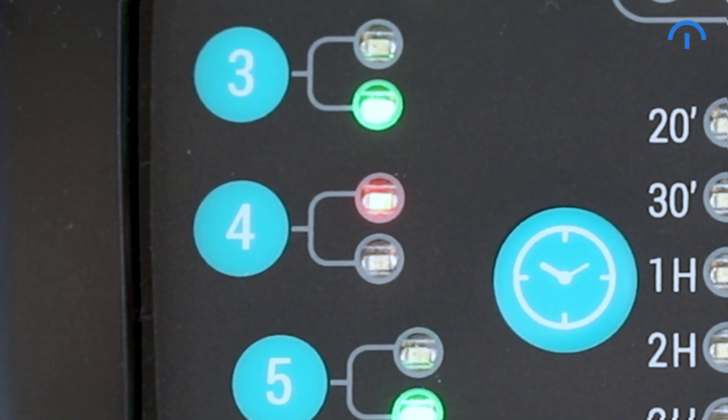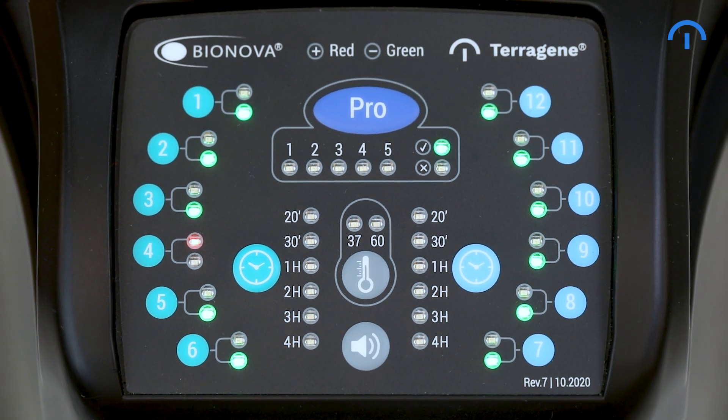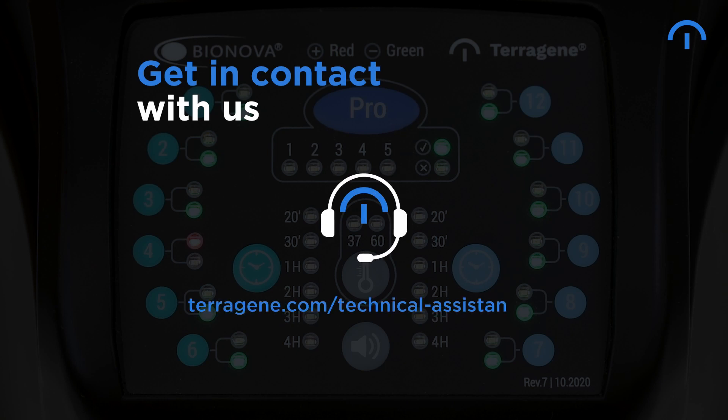If a red light appears, this means there is an issue with that position. It will be automatically blocked and you can normally use the remaining positions. Please get in contact with us so we can help you solve whatever the issue with that position may be.